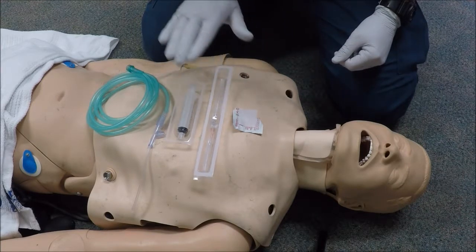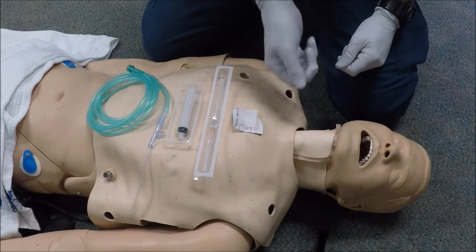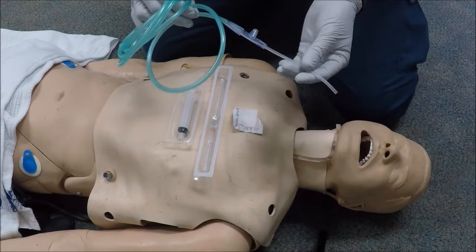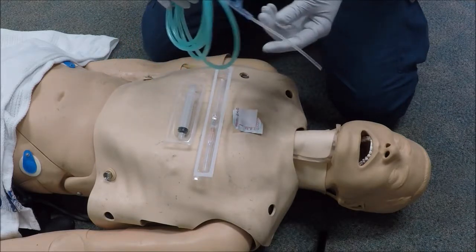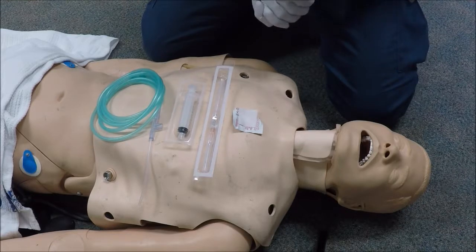gauge cannula. You have to have a 10 ml syringe to confirm positive placement of your cannula inside the trachea by positive aspiration of air, and a modified oxygen hose and a suction catheter to provide jet ventilation through the 14 gauge cannula and provide emergent oxygenation until a definitive surgical airway can be performed.